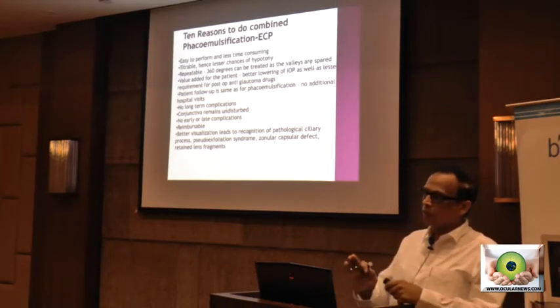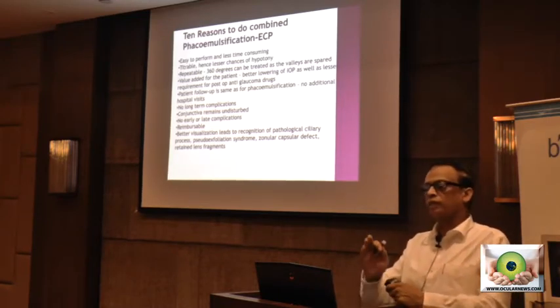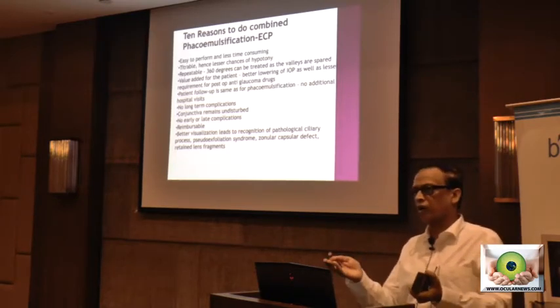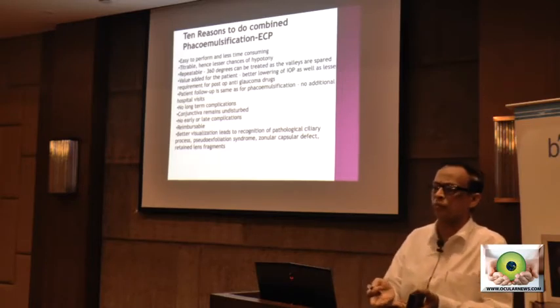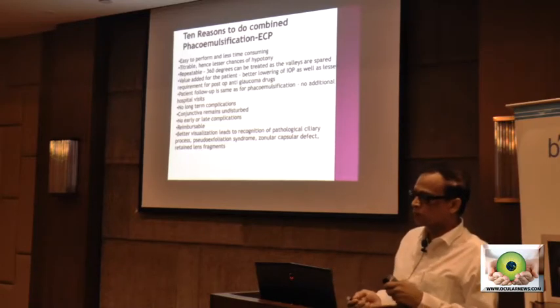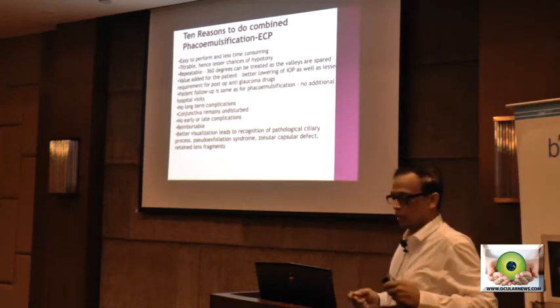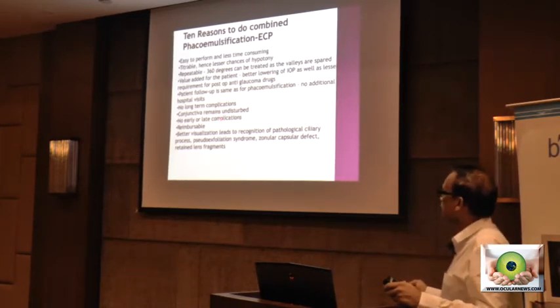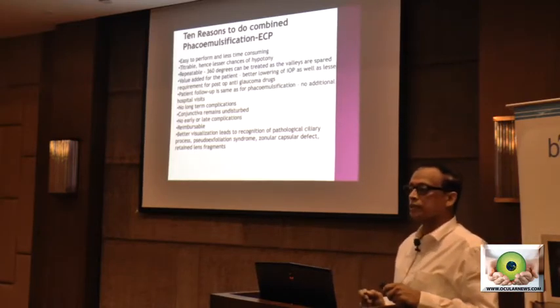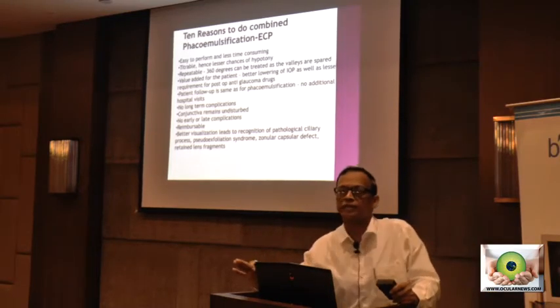In trabeculectomy, when we do a filtering surgery, we have to call our patients more often and for a longer period of time. When we do a phaco, we call them only next day, and then many of us call only after 1 month. Some of us may call one visit more in between. Similar is the follow-up requirement after ECP as well. So follow-up means less money spent by the patient, less time spent by us. There are no long-term complications, as we shall see in the slides which are going to come. The conjunctiva remains undisturbed. Since the conjunctiva has not been disturbed, it is still amenable to future filtering surgeries.